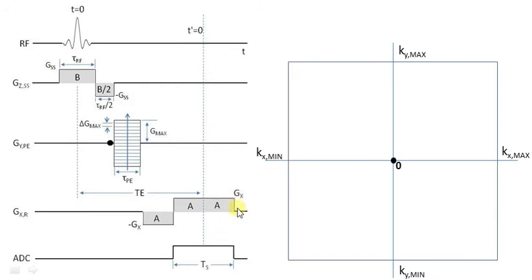And then at the end here, we go off. This is the end of one repetition time, or one TR. So the next TR, we come back to this point. Again, we apply an RF pulse and Z gradient, and now we're at this point in time again, and we're going to apply the next phase encode step. This time the phase encode gradient isn't quite as strong.